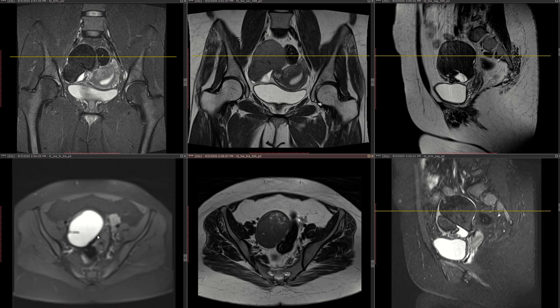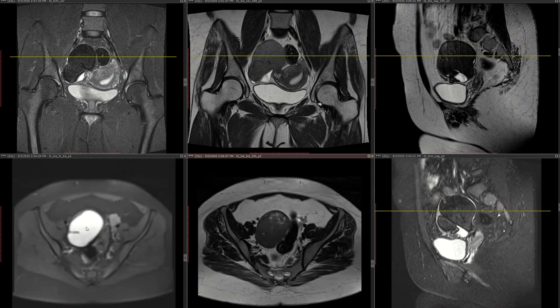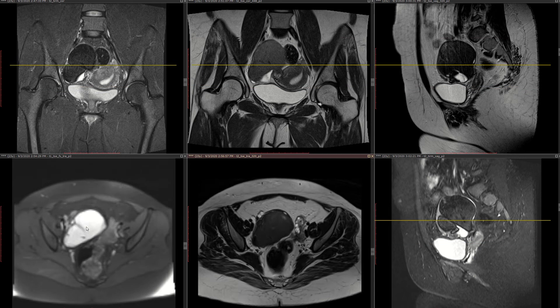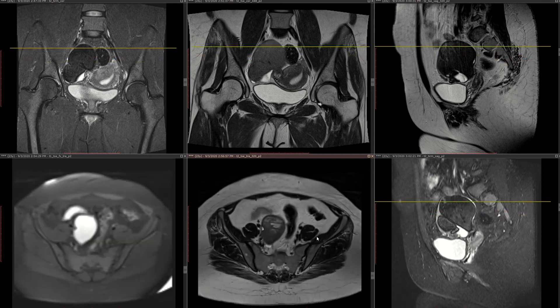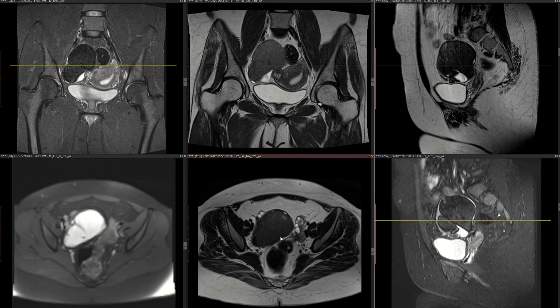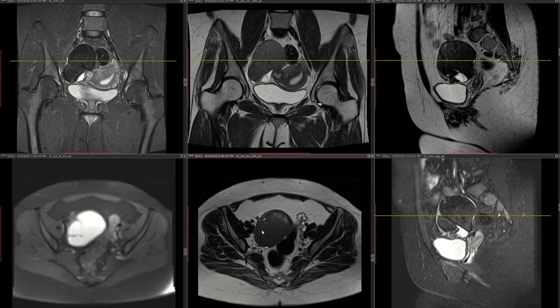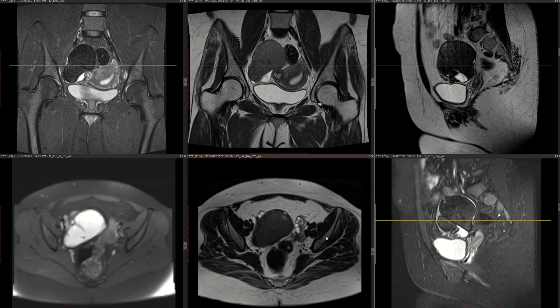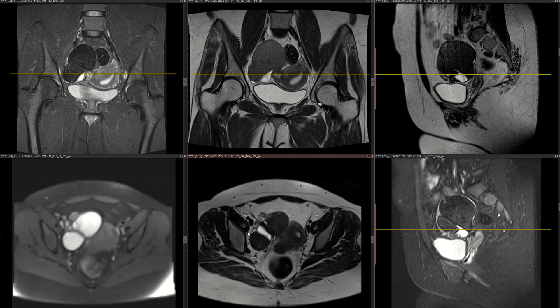Something which is T1 very bright and T2 very low would be consistent with chronic blood — like hemosiderin. That is seen in the pelvis in endometrioma, so the strong differential here would be endometrioma. In endometrioma, signs like T2 shading are described, however it is not predominantly seen here because it is all black.